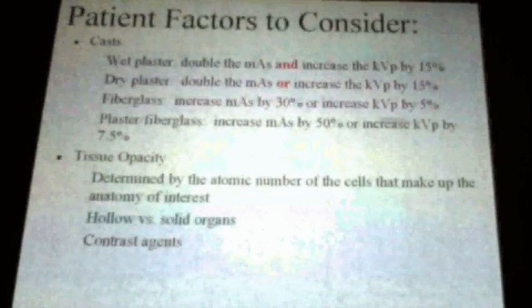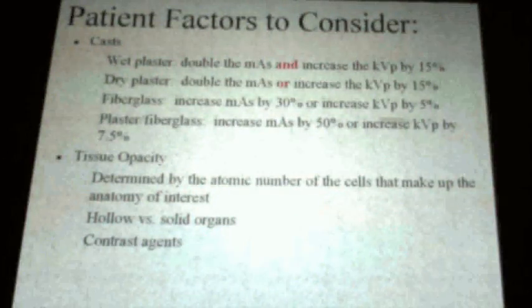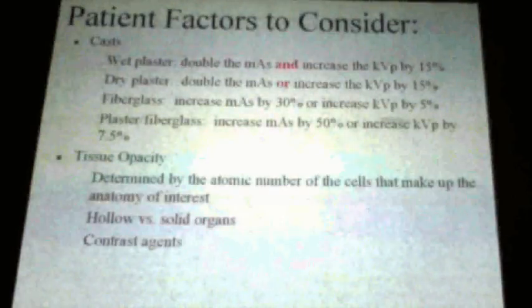So you've got iodinated contrast material, what else? Isn't air? Air, yeah. Air is a contrast material. Did anybody ever watch an upper GI done? Yeah. Anybody see an upper GI?